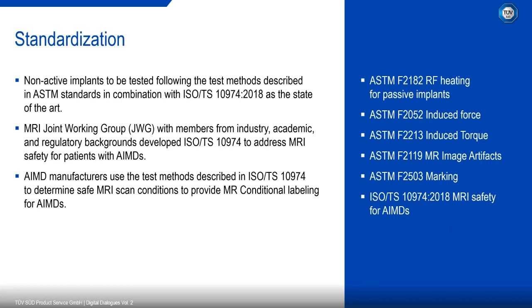The MRI Joint Working Group, with members from industry, academic, and regulatory backgrounds like me, developed ISO TS 10974 and the PC76. All these standards are used by testing laboratories and implant manufacturers to determine safe MRI scan conditions for MR labeling.